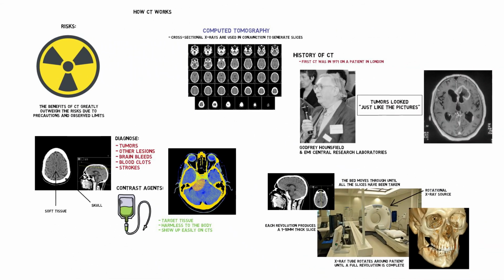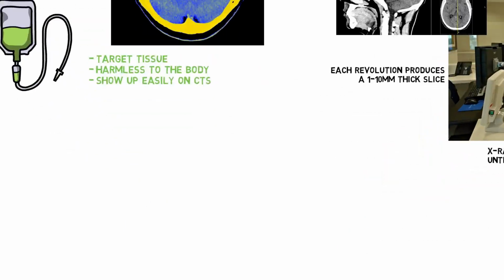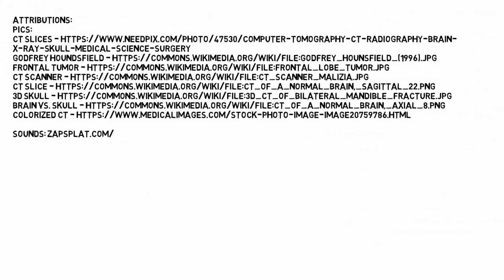CT scans have revolutionized the bioimaging world and saved countless lives. The overlapping X-ray technique, using trajectories at different angles, combined with new technological advancements in computation, made this all possible. This ends the video on how CT works.